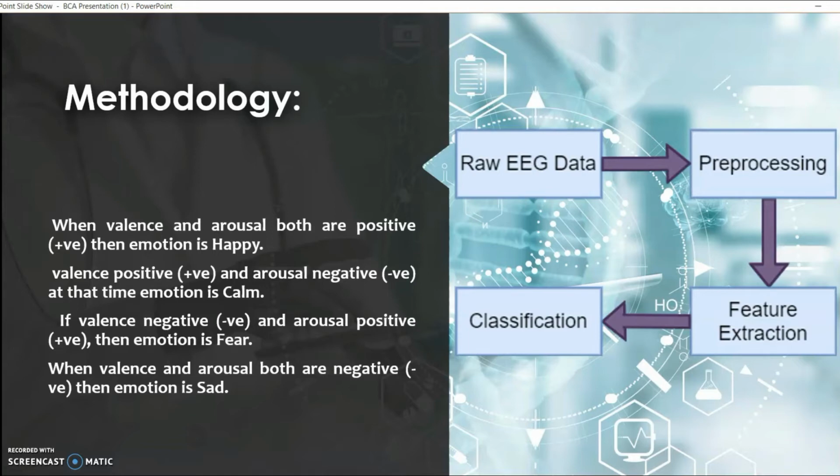The methodology in this experiment is mainly divided into two vital parts, which are important to follow to get the best result for this data. The first part, the feature extraction, is undergone to determine the important features of the brain signal from all channels of the EEG machine. Before the second part of the process, which is classification, we used MFCC to extract the features, and in the second part we used MLP to classify the brain signal to see the emotion of the dyslexia kid.